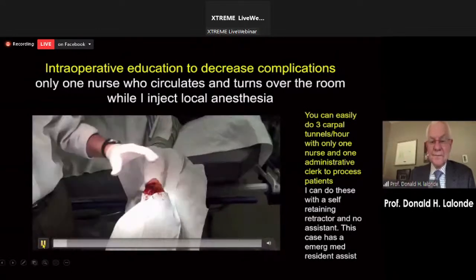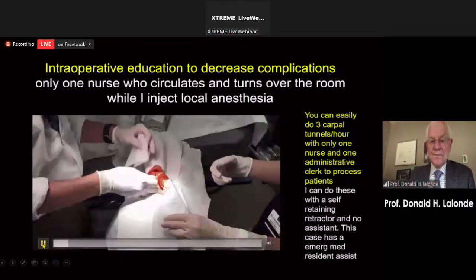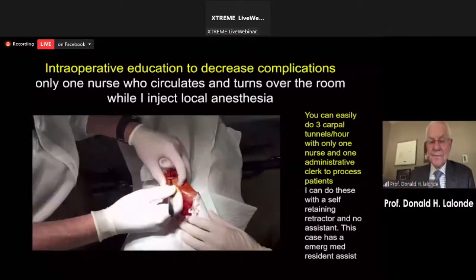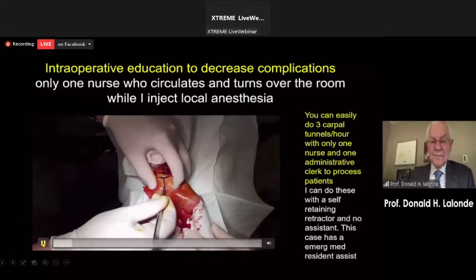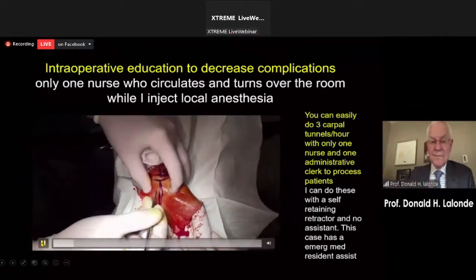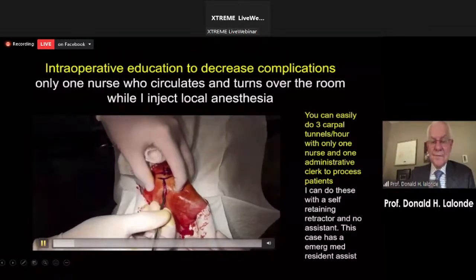Tell me if I bother you even one little bit during surgery here. Can you straighten out your fingers for me? Oh, that's great. Thanks a lot. You didn't think we were going to be asking you to help, did you? Is it hurting at all? I'm sure you can feel me pushing. Not really, or not at all? No.